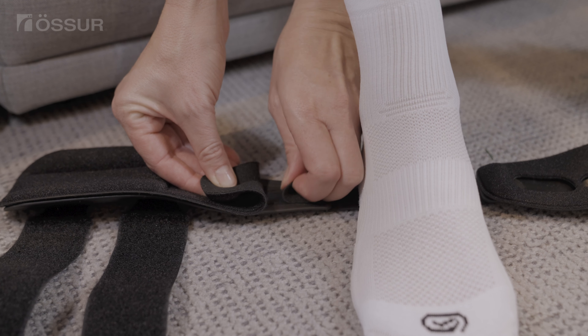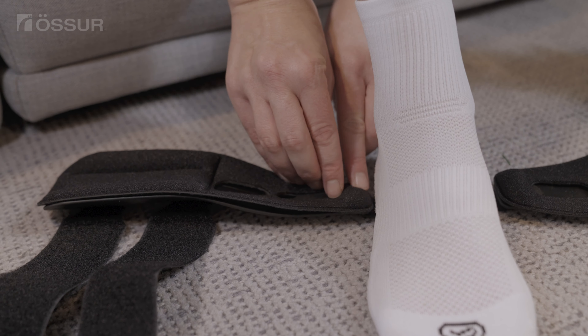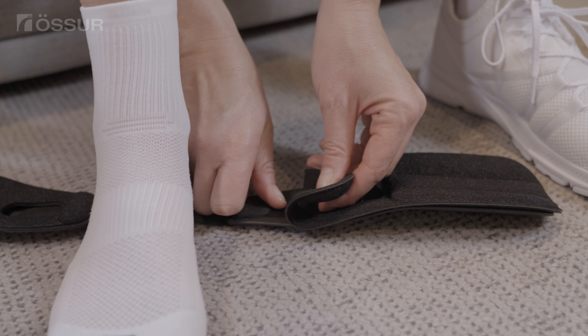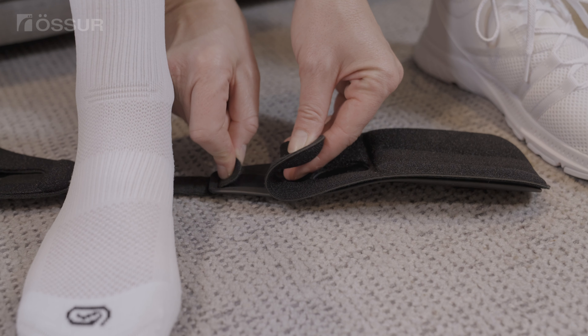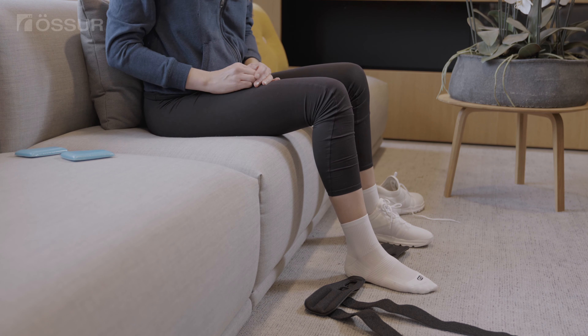If required, adjust the heel width by lifting the lower part of the liner and adjust the hook and loop tab. The heel strap should fit snugly under the foot, be equal on both sides, and the bottom of the stirrup should be slightly above the bottom of the foot.